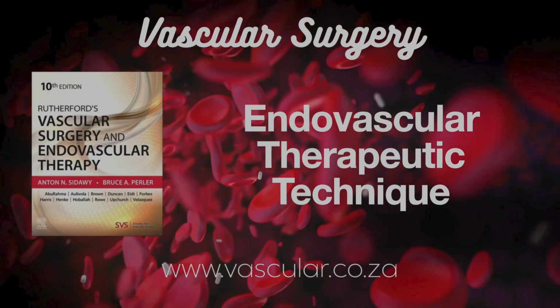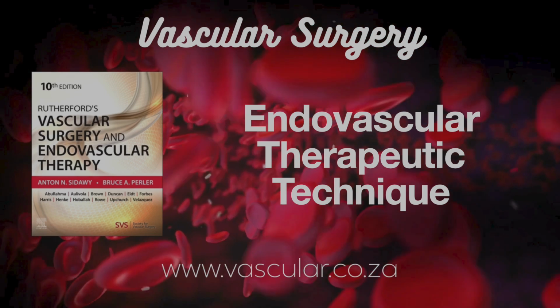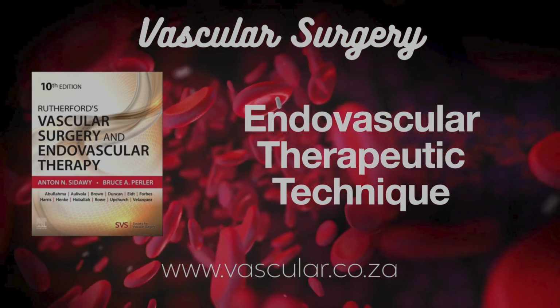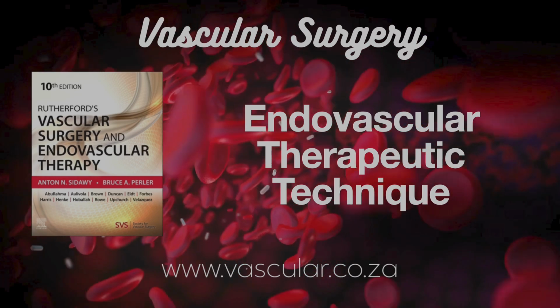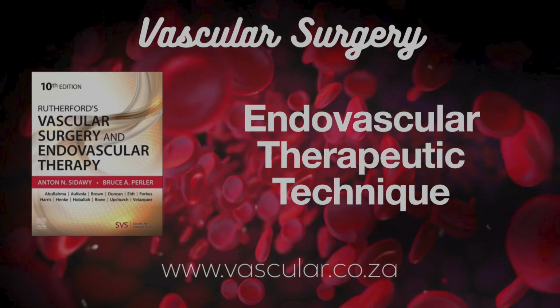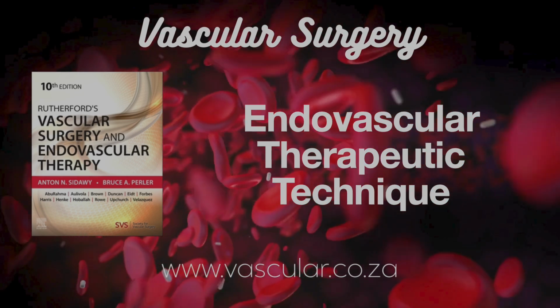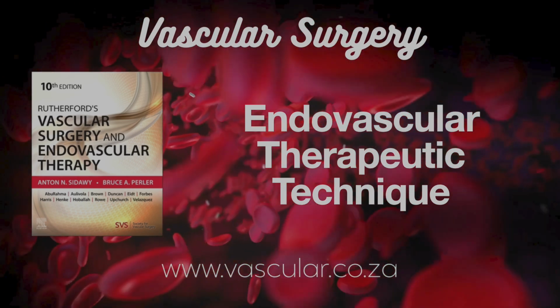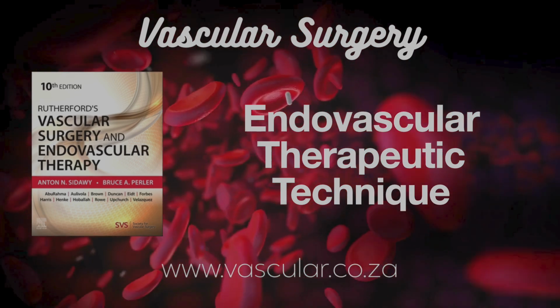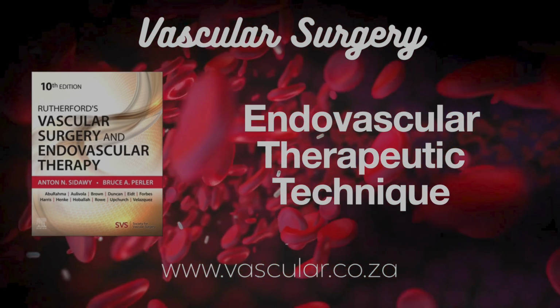Then there's orbital atherectomy. How's that different from rotational? Orbital, like the Diamondback 360-degree system, also uses high-speed rotation, but instead of a fixed burr, it has an eccentrically mounted diamond-coated crown. As it spins, it orbits around the guide wire, creating a wider path. Exactly. The orbital motion makes a slightly larger effective cutting diameter than the crown itself. It also allows for differential cutting based on how compliant the vessel is.